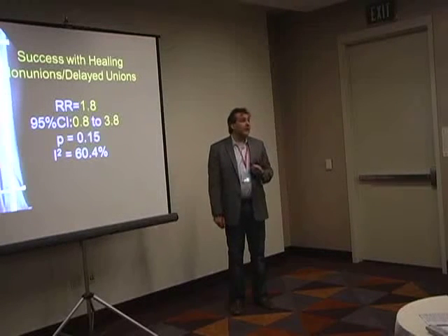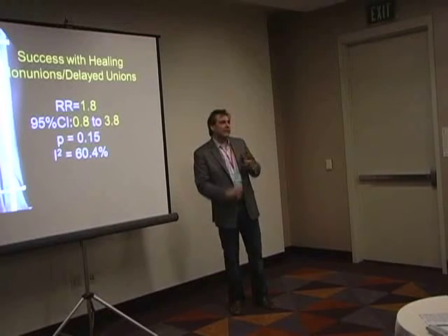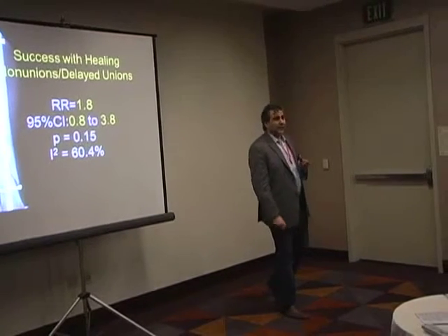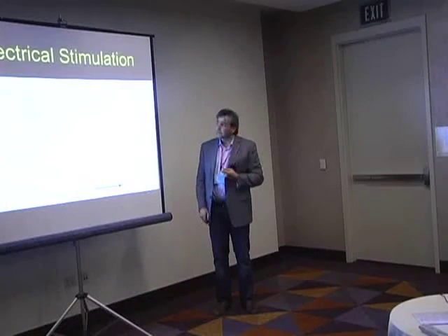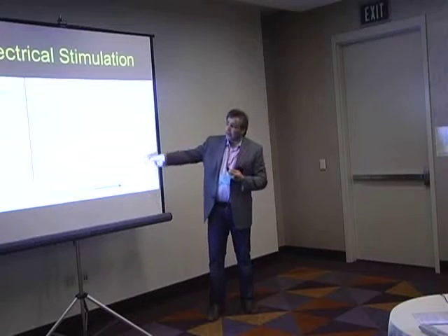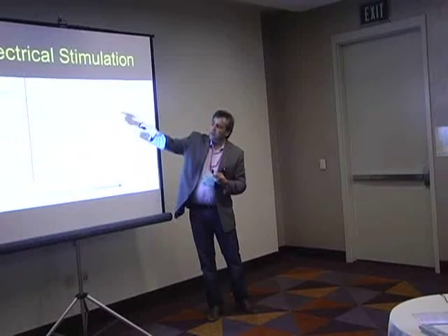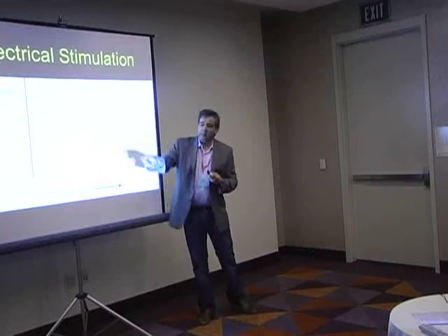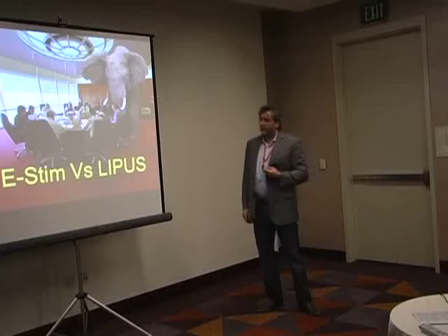So in 7 years, there's been a lot of changes. And that is why I've moved the eStim data to be a little bit ahead of the ultrasound, simply because the last 7 years has seen a lot of new publications that have helped us make more inferences about the overall effect. This was the original data set, so you can see this side favors eStim. All the dots are the results, and they're mostly on the favoring side, but they had a huge amount of variability. They were small studies, right? So they had these huge confidence intervals, and that's why we were uncertain.